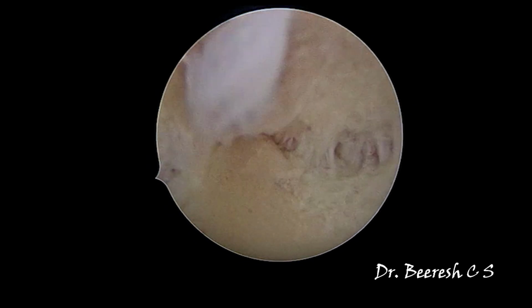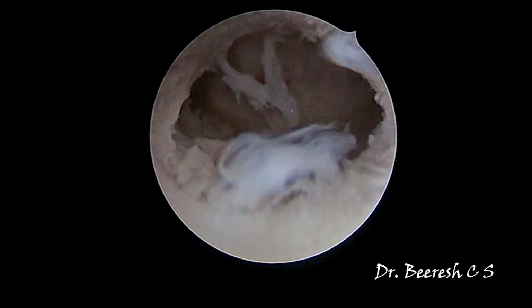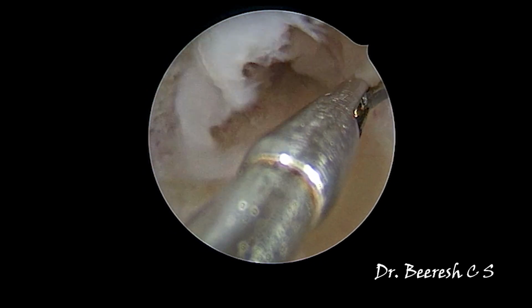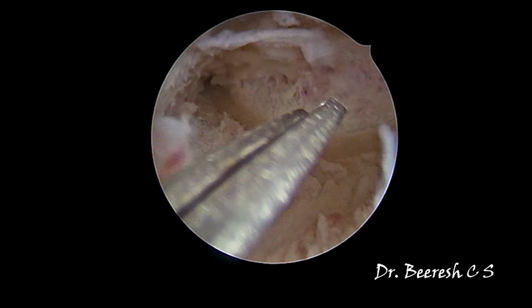Here I am just making a few more nicks. This is the final panoramic view, and you can appreciate how much the increase in the volume of the cavity has been achieved. Again coming back, rechecking and giving the final few cuts.